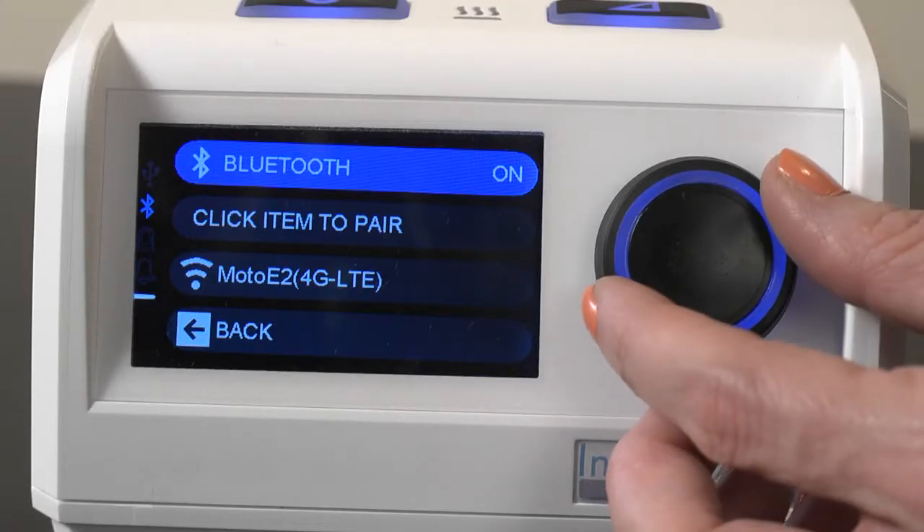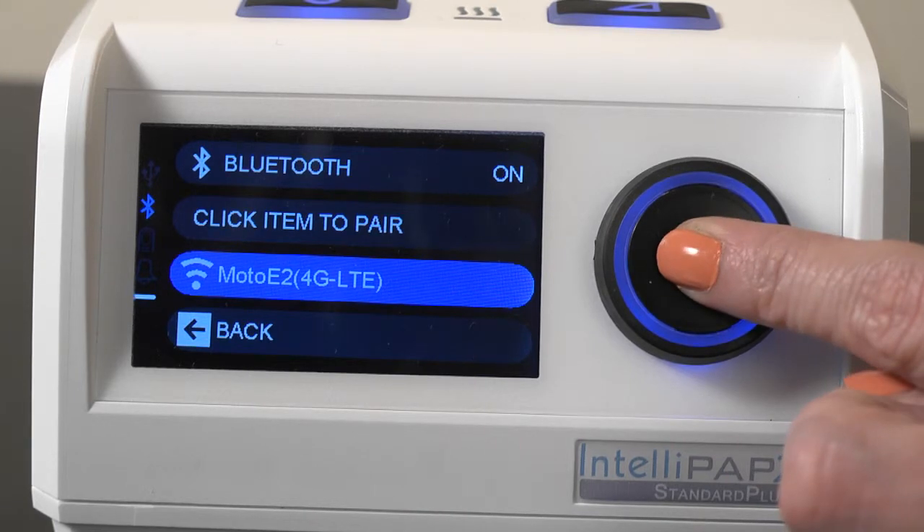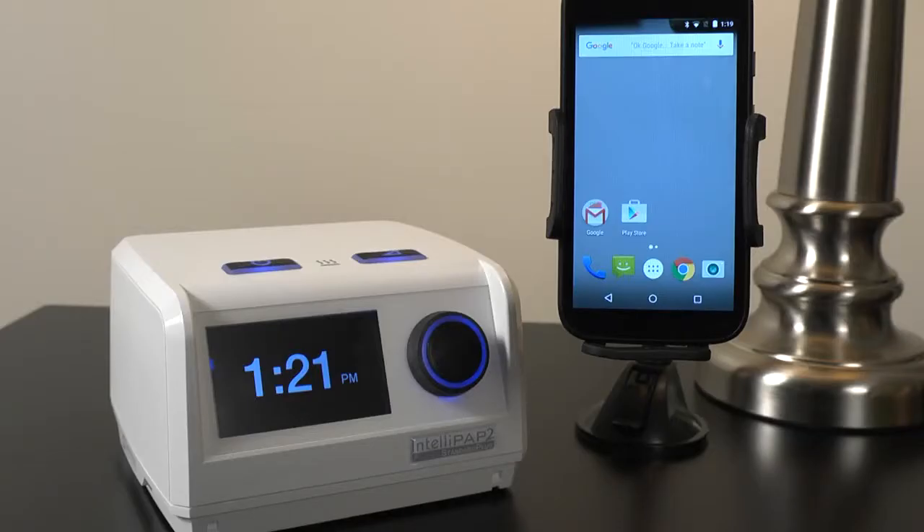Then, on your IntelliPAP2, select your Android device to pair it. The IntelliPAP2 will show Pairing and then Success when complete. You have now successfully connected the IntelliPAP2 device to your Android device for use with the DeVilbiss SmartLink app.